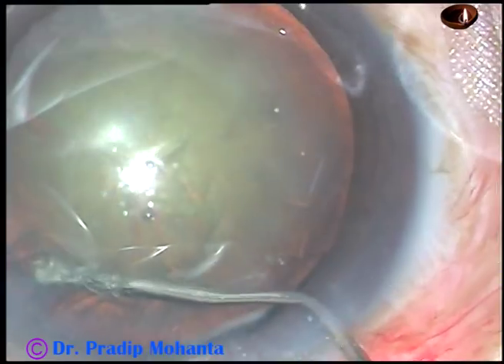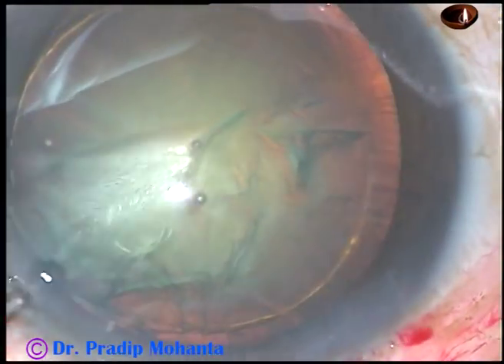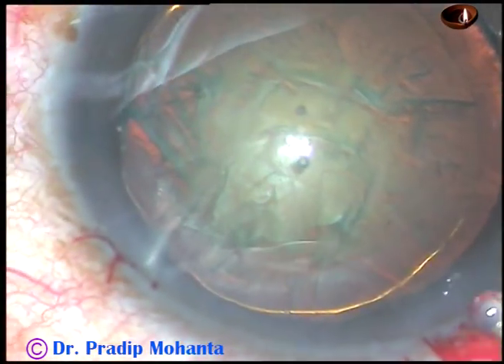Hydrodissection is then done. Hydrodelineation is also done. Hydrodelineation has produced a beautiful golden ring in this case.